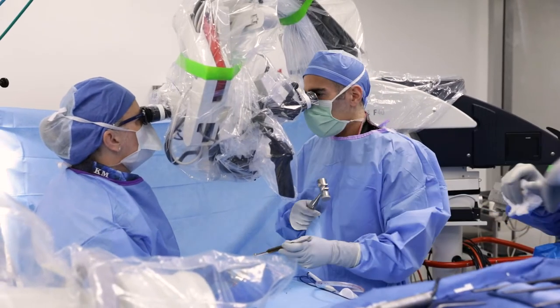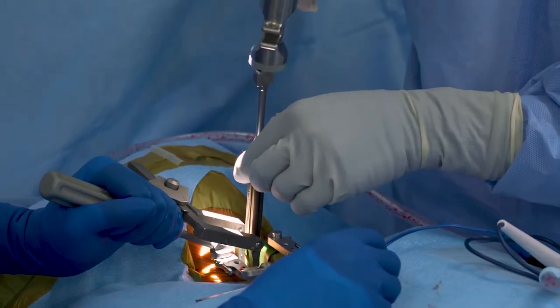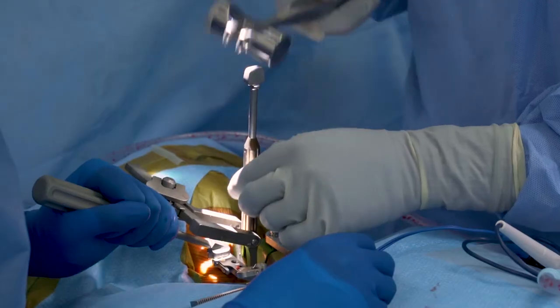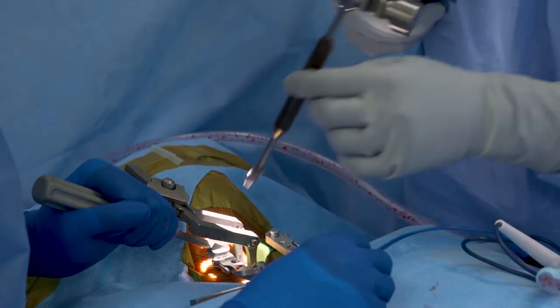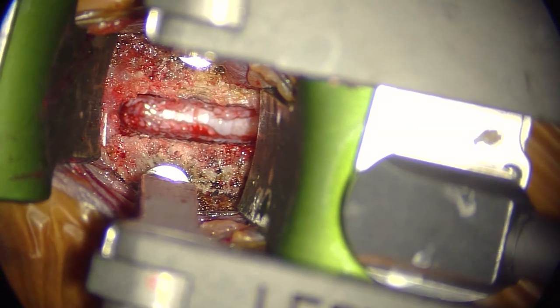Once the height has been determined, you have the option to use the broach end of the trial to prepare the end plates. The disk space and vertebral end plates are now ready to receive the implant.